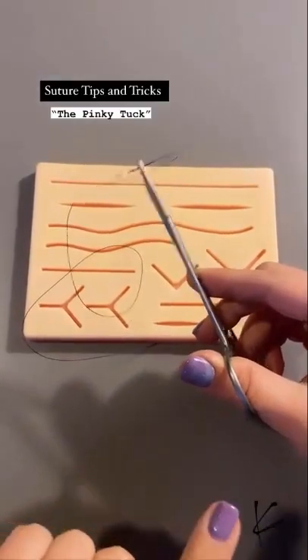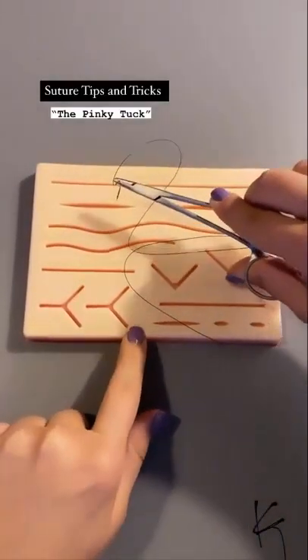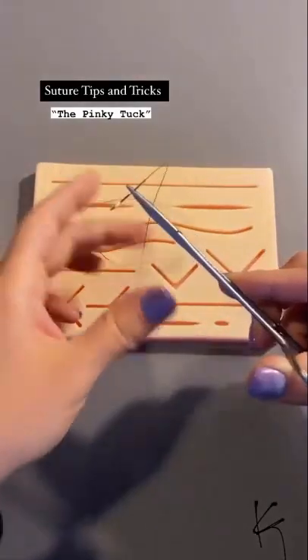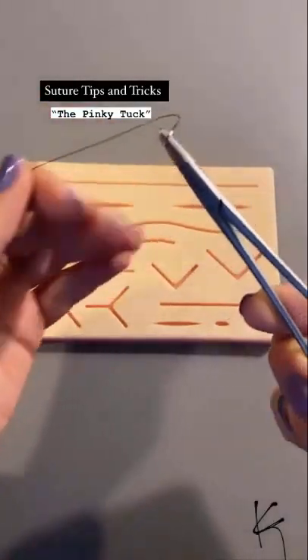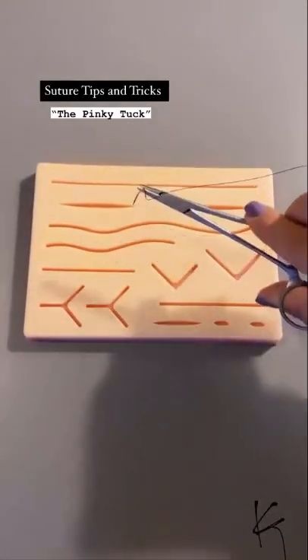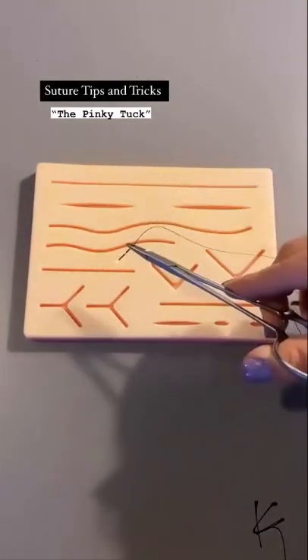One of the things they don't teach you in school is how to get rid of the annoyance of having nylon all over the place when you're trying to suture. What I like to do is take the nylon and tuck it right behind my pinky — then you have complete clearance to put your stitch in.